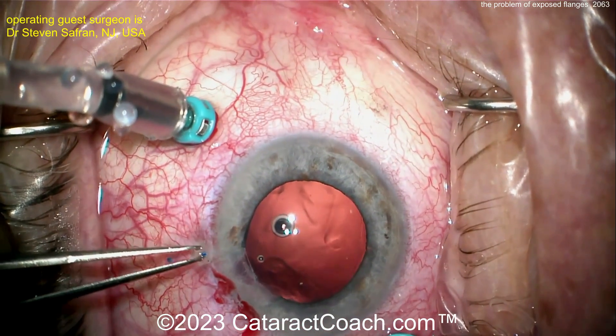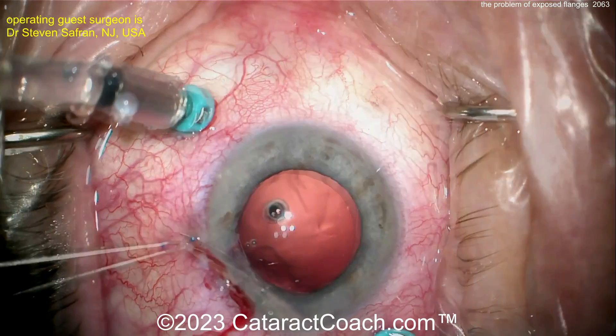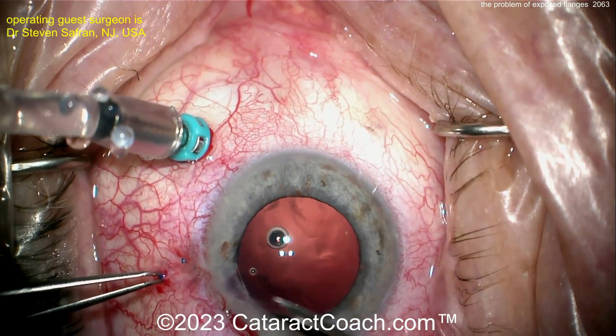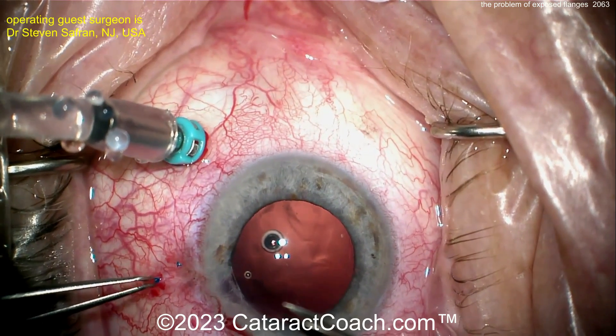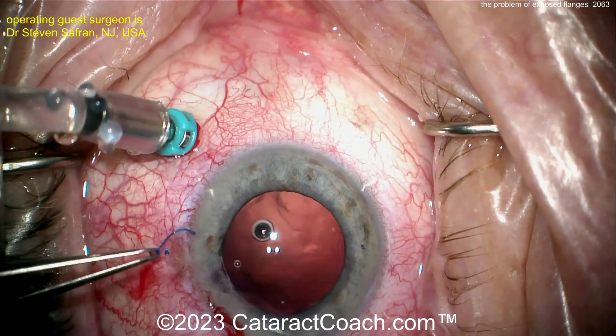So this belt loop procedure — take a look how loose this is. It's really quite loose. Now he's going to cut off one flange and then pull out the other one. Now he's going to leave that area of sclera alone, let that heal up a little bit, and get the proline out of there.